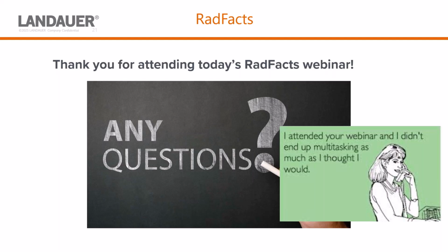All right, next question. Is RadFacts a good thing for small departments? Yes, 100%. Again, for radiation safety committee meetings, if you still have them, it's a nice way to present the data. And you may not have to do a large PowerPoint. You can log in and just share your screen, but it helps you track that data.